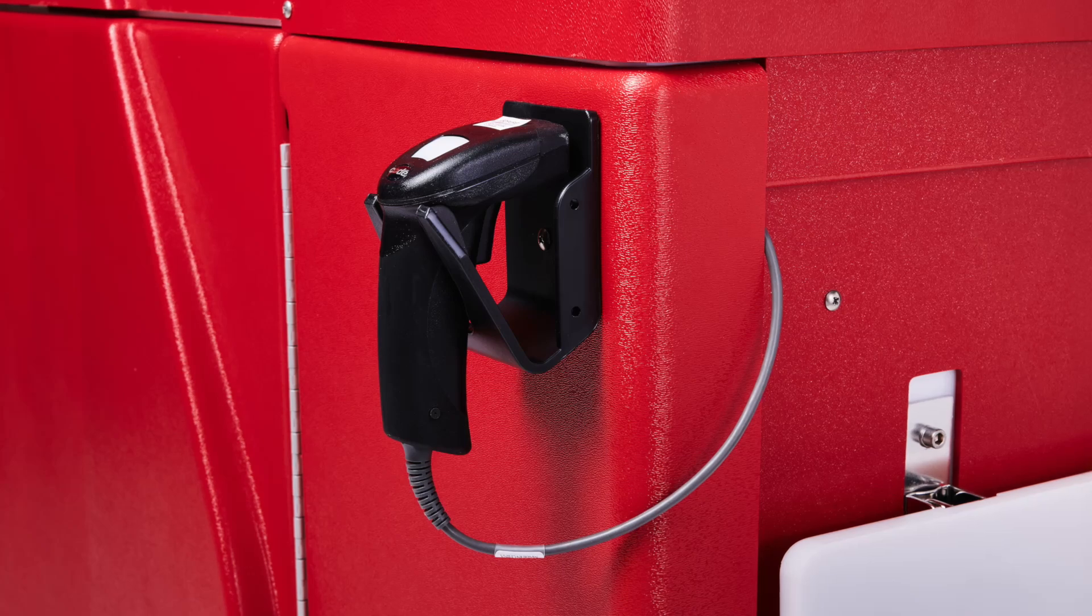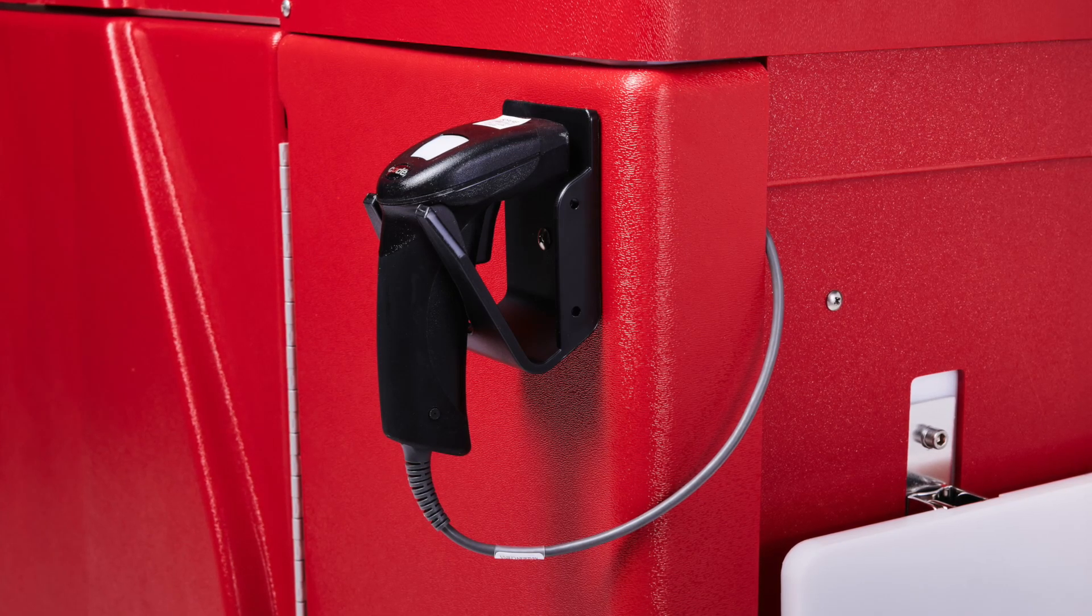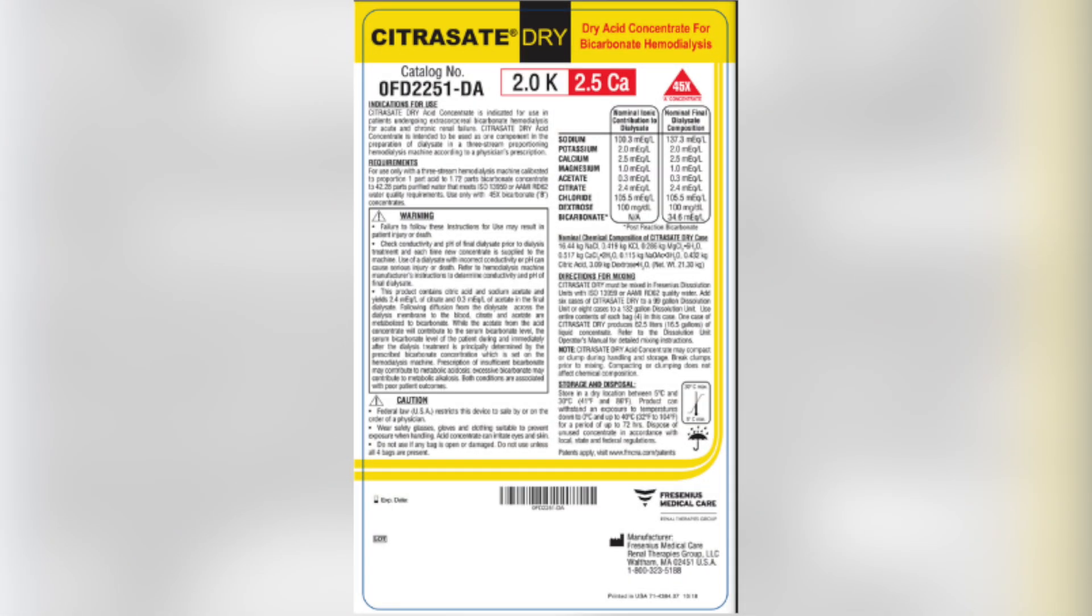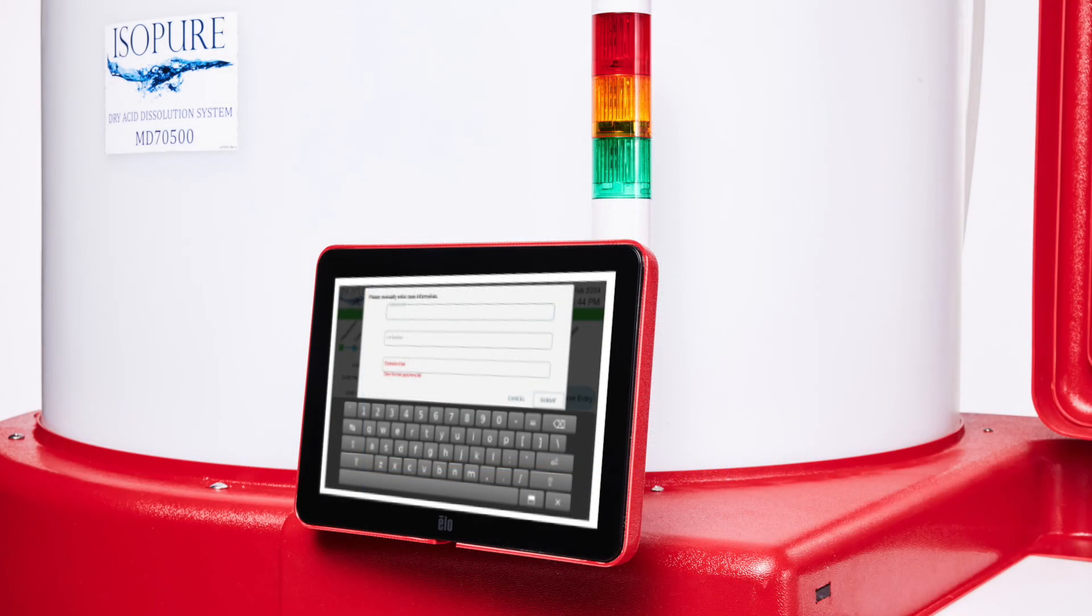If for any reason you were not able to scan your dry acid concentrate, the case barcode, expiration date and lot number are located on the dry acid concentrate label and may be entered manually. Select Manual Case Entry to perform this function.